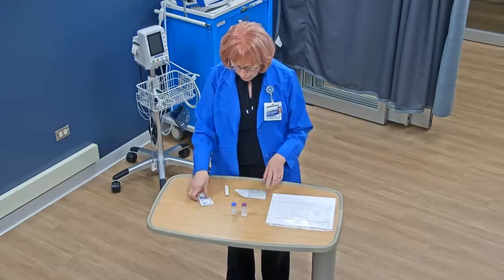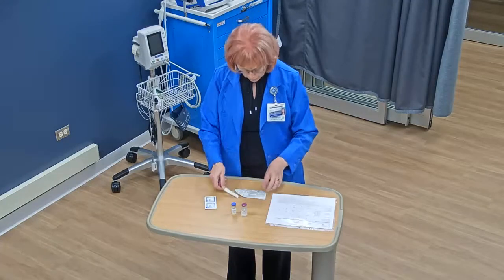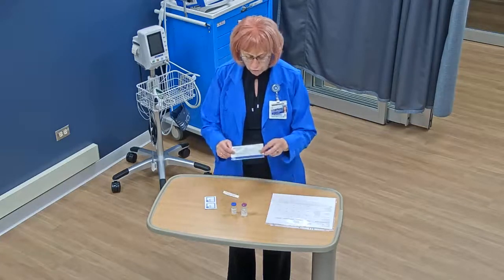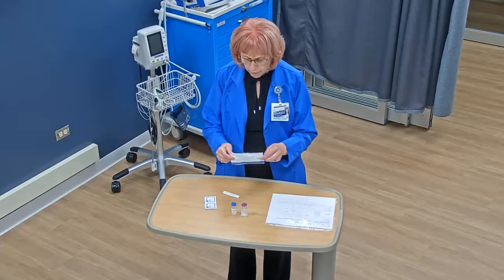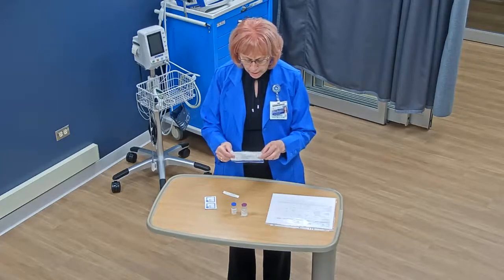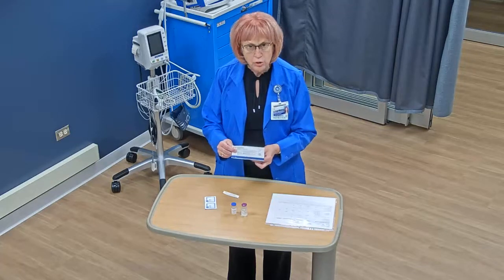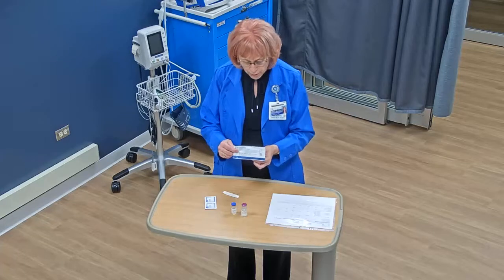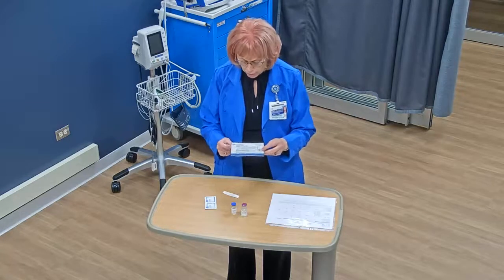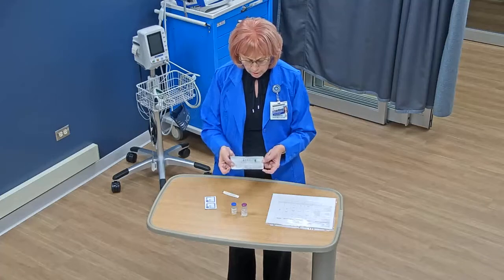Other equipment: I have alcohol wipes. I have here a blunt cannula or a vial access device. And then here I have my syringe and needle. This medication is ordered IM — an intramuscular injection — so I have a needle that is 1 inch long. I need to draw up 2.8 milliliters of liquid so I have a 3 milliliter syringe, and I can see that on the label of this package.